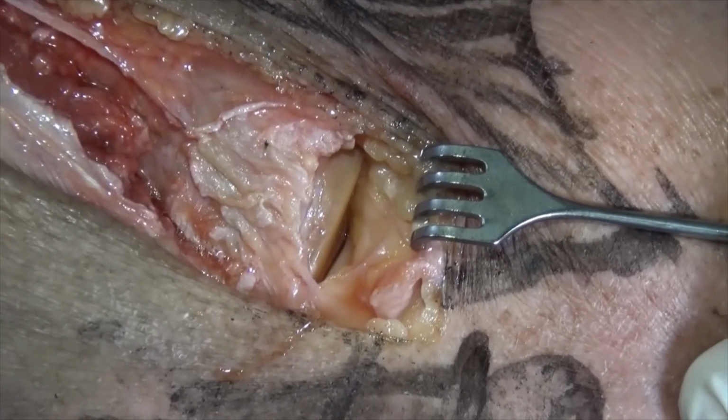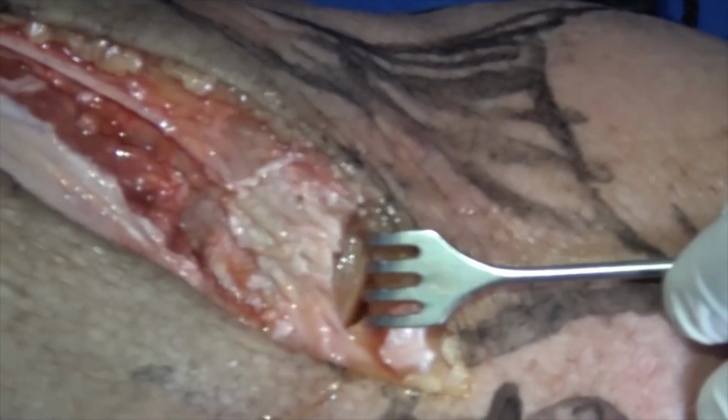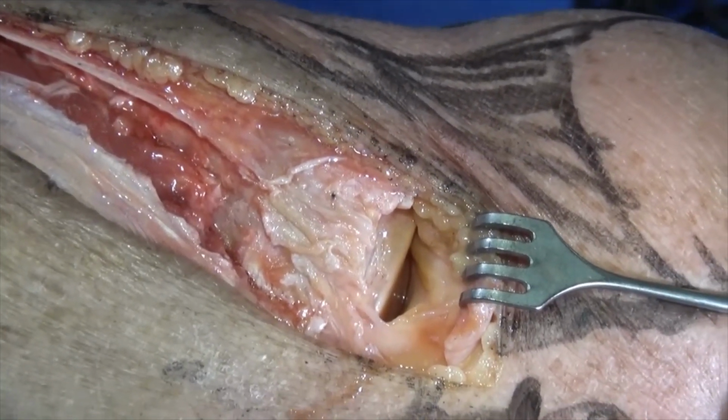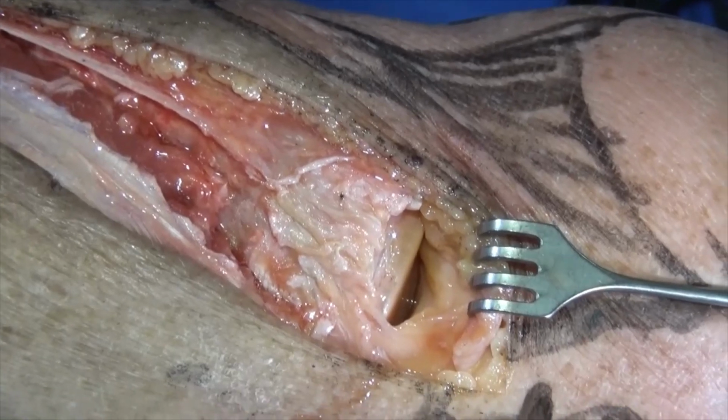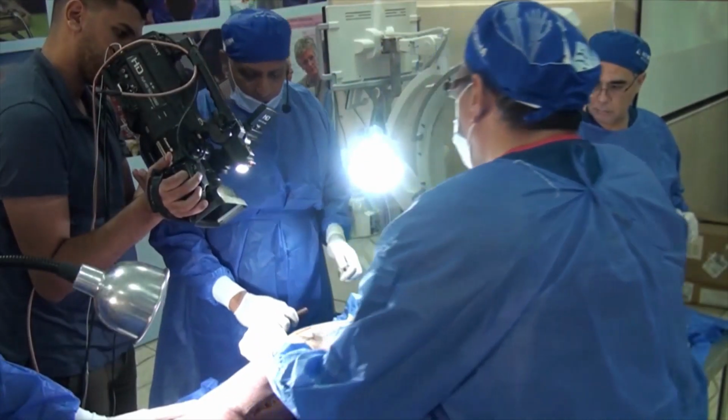So can we just do this part, which is the smallest part of this approach, and then we'll take you back to how to get underneath the popliteus and the fibula collateral ligament to get into the posterolateral fragment that we were talking about yesterday. So can you do this? And we'll come back to you. Thank you.